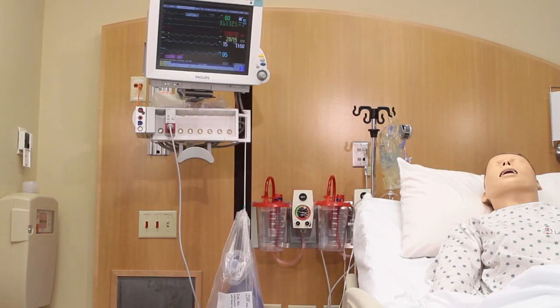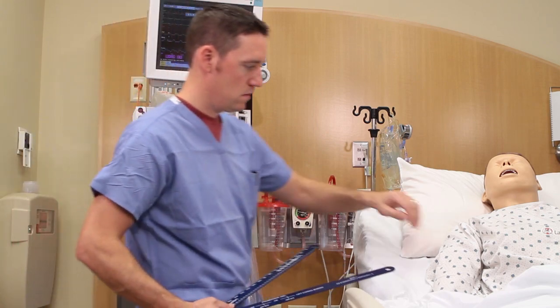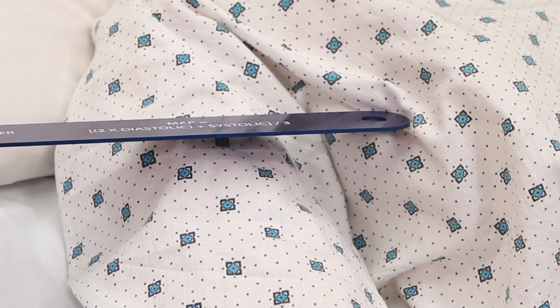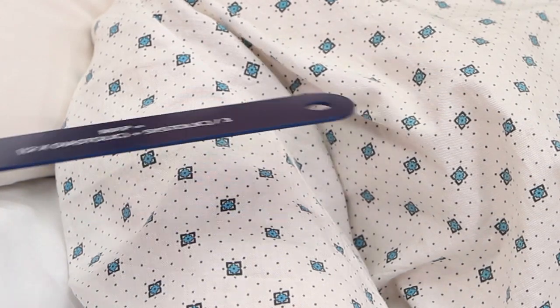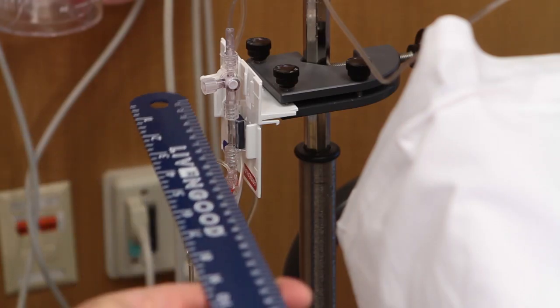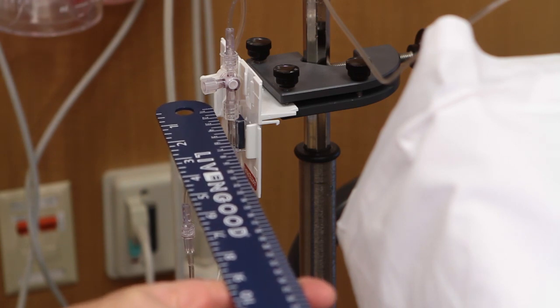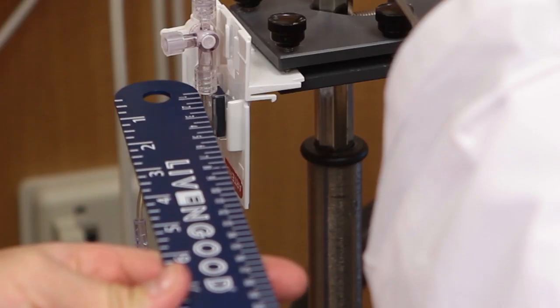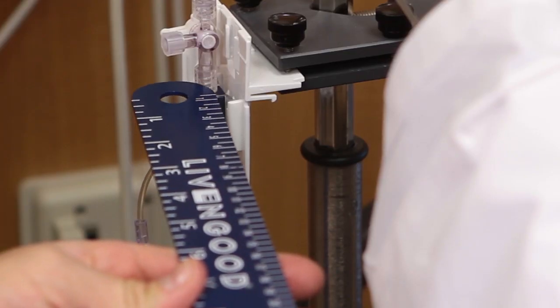Directions for use of the Leppert Level are simple. Grasp the Leppert Level at the pivot point with one hand. Place the end of one member at your patient's anatomic landmark. Now center the bubble and take note of where the end of the other member is in relation to the transducer. Adjust the height of the transducer accordingly. Repeat this process to verify accuracy.